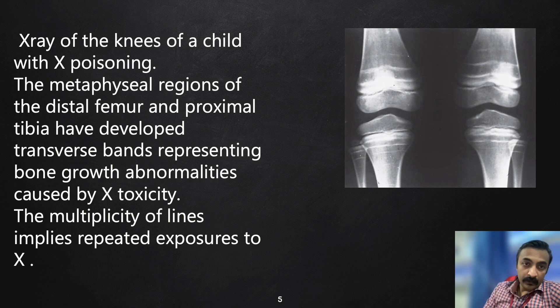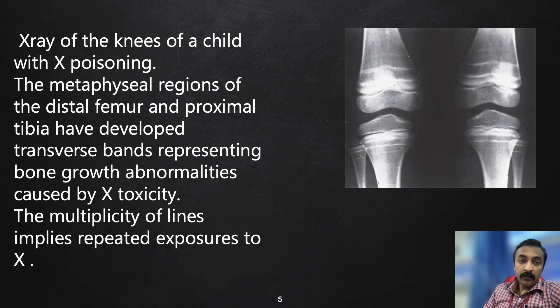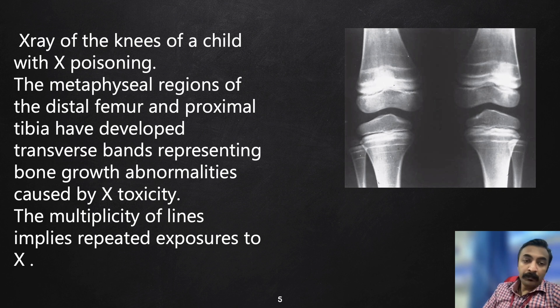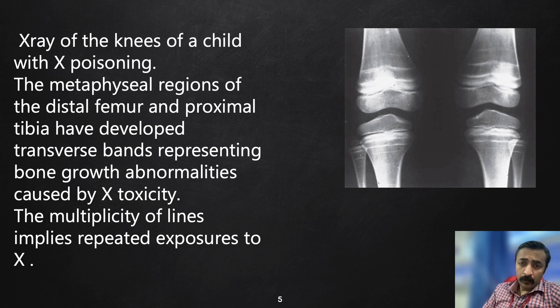Now what you see here is an X-ray of the knees of a child with X poisoning. The metaphyseal regions of the distal femur and proximal tibia have developed transverse bands representing bone growth abnormalities caused by X toxicity. The multiplicity of these lines implies repeated exposure. So what are we dealing with? You can clearly see these lines.